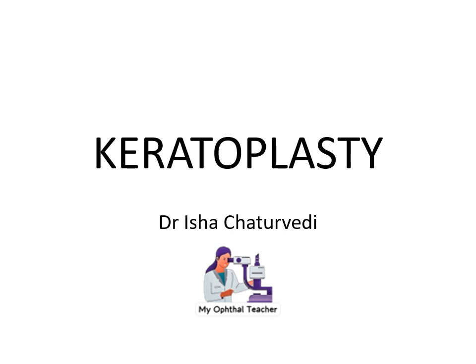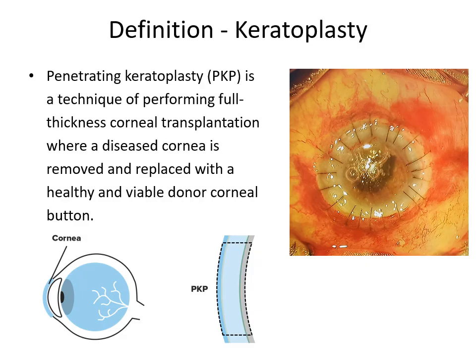The topic for today is keratoplasty, penetrating keratoplasty to be specific. Penetrating keratoplasty, abbreviated as PK or PKP, is defined as a technique of performing full thickness corneal transplantation, as you can see in the diagrammatic representation, wherein a diseased cornea is removed and replaced with a healthy and viable donor corneal button. This is the picture of a post keratoplasty patient in the immediate post-op period.